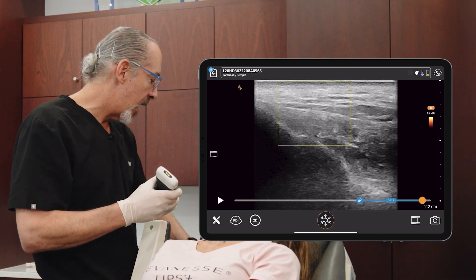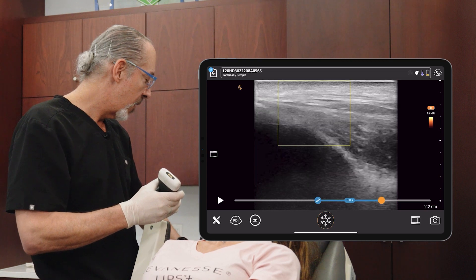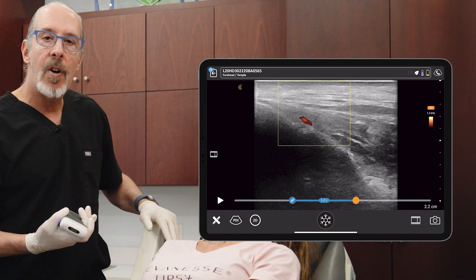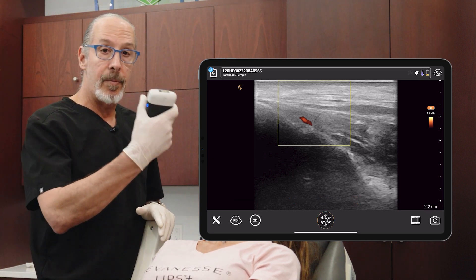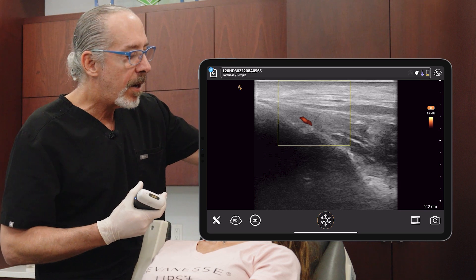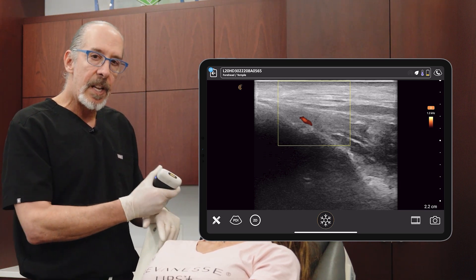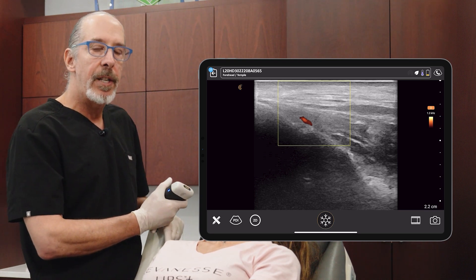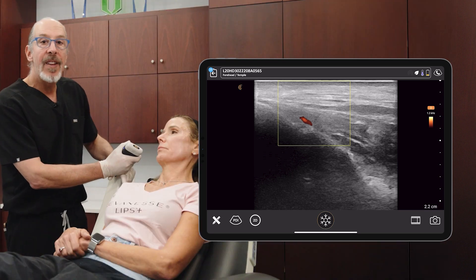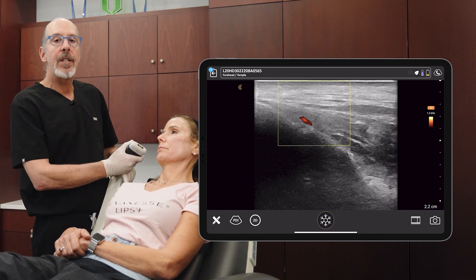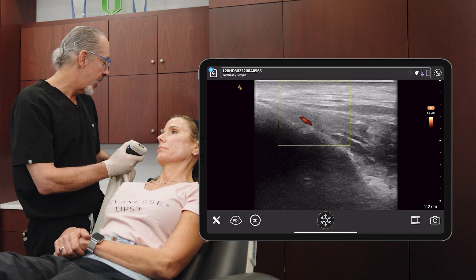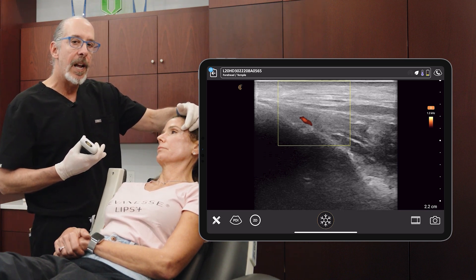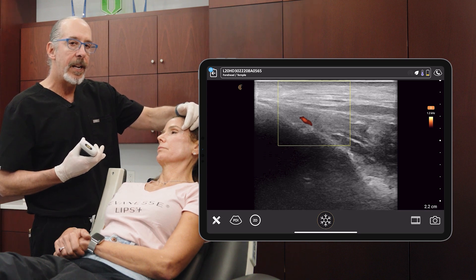Doing this search, I came across the deep temporal artery — specifically the anterior branch. There are two branches: an anterior and a posterior. The anterior branch is going to be right near the orbital rim and runs along the temporal bone. That's actually at risk when you're doing deep injections, so I highly recommend doing vascular mapping before deep injections in the temple. In this patient, it was very close to the injection point used for the one-up, one-over technique in that deep area.